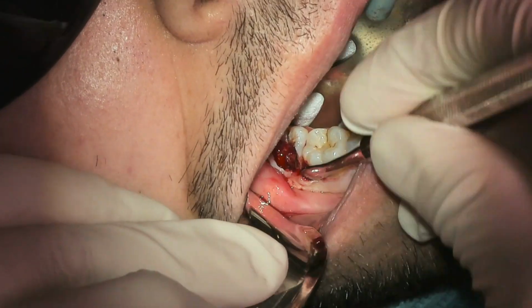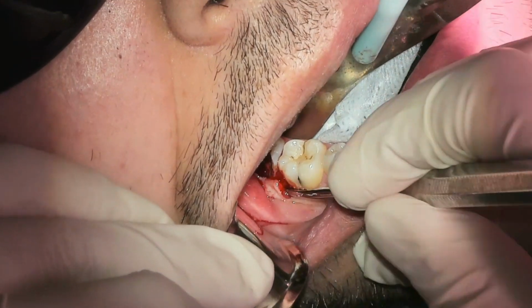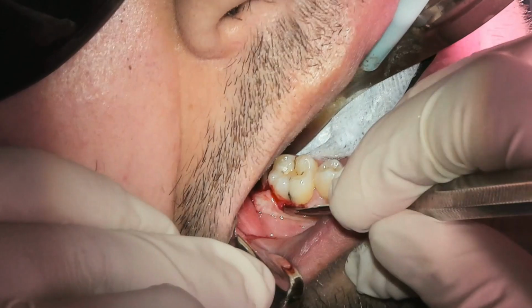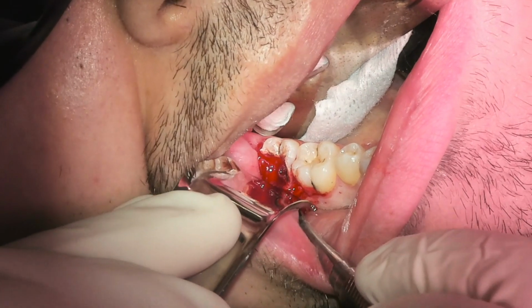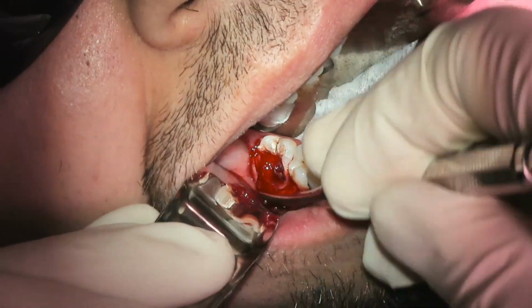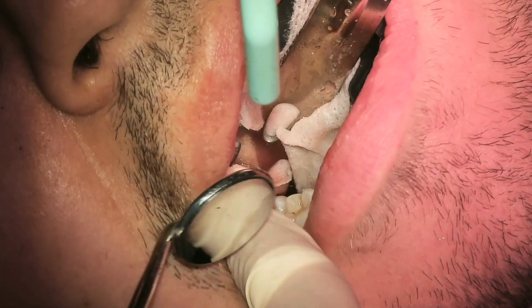So now we move on forward, laying a flap. So now I need to see the interface between the tooth and the bone, so I can know exactly what I'm elevating off of, especially if it's poor visibility as it is here on the lower right quadrant. It's pretty far back, so I want to make sure I can see everything, because you can do a lot more damage than not if you can't see it. So right there, you can see the interface between the bone structure, and it looks fantastic.